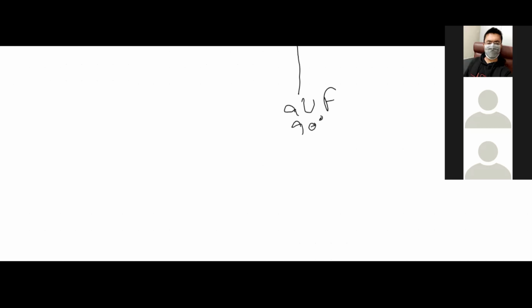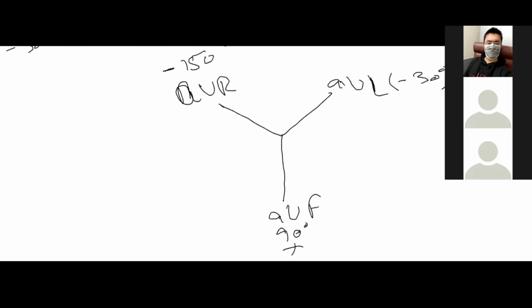It is positive. Here lies lead 1, which is at 0 degrees. There we go for lead 2, which lies at positive 60 degrees.